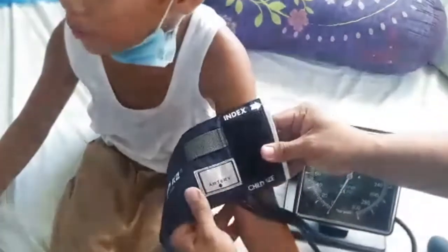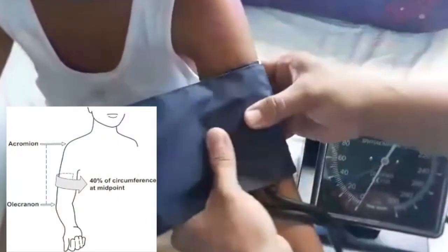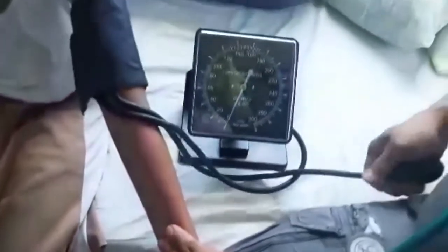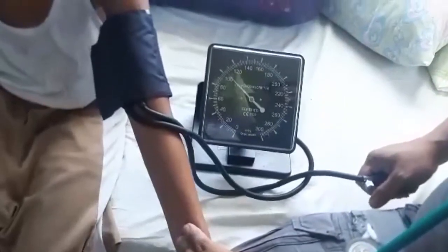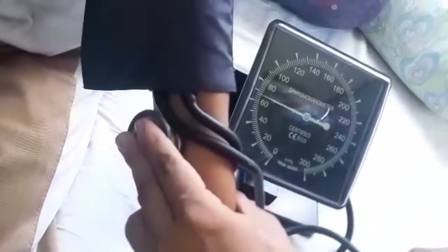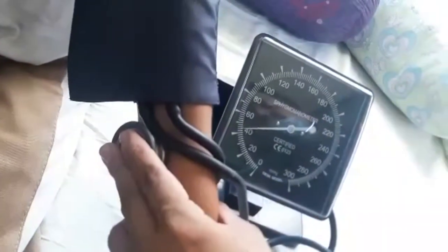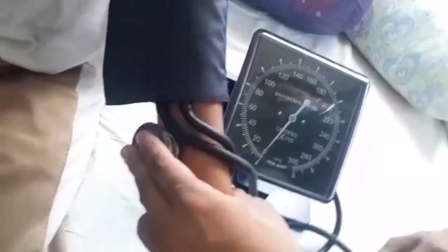The lower part of the cuff is placed 2 to 3 centimeters above the antecubital fossa. The bell of the stethoscope is then placed over the brachial artery. The cuff is inflated 20 to 30 millimeters mercury above the point at which the radial pulse disappears and is then deflated at a rate of 2 to 3 millimeters mercury per second. The first and last Korotkoff sounds are measured and recorded with measurements that read to the nearest 2 mm mercury.